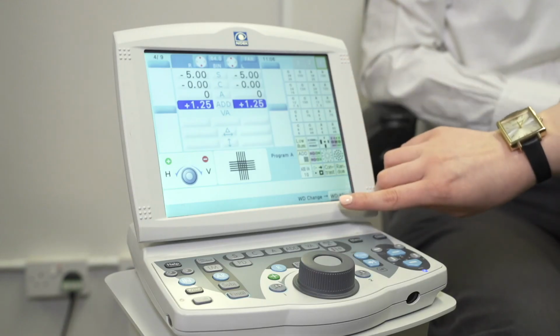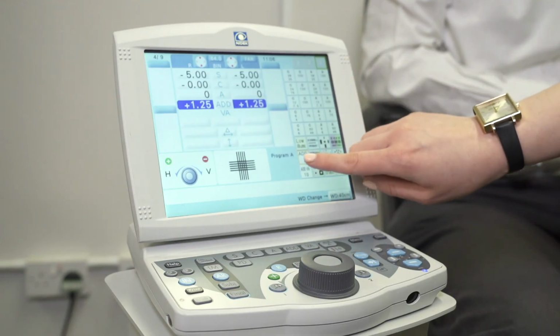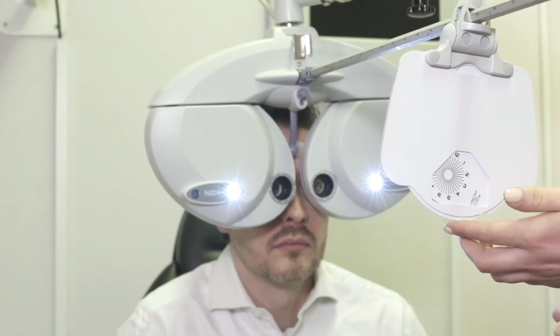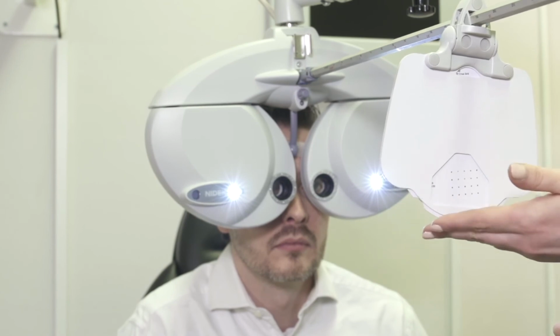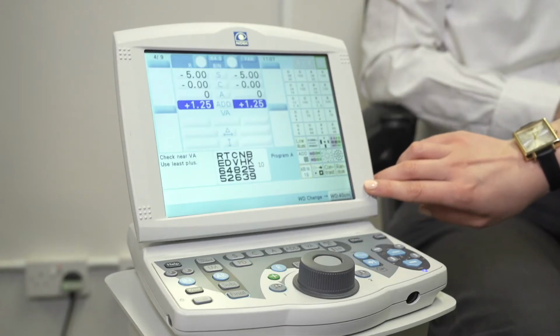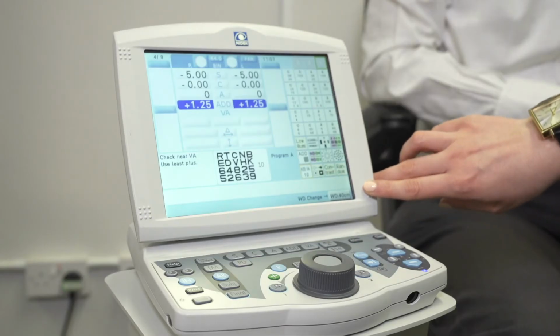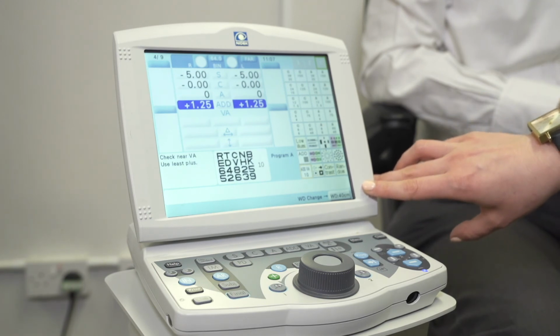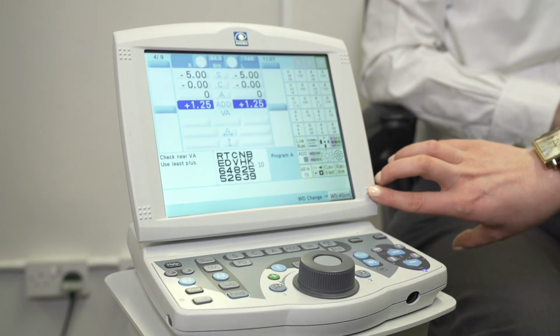On the touchscreen panel here, we also have 2 reading options. Pressing the first option here, this is our reading grid. And if we spin the wheel around until the patient can see the grid as well, we're asking them to compare whether the lines are clearer horizontally or vertically, making the adjustments as recommended on the screen here. The second reading option is our N10 reading option, and this just checks that the patient's able to see with their final reading prescription comfortably at a visual acuity of N10.